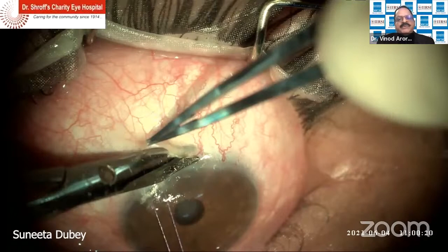What about leaving a little flower, a skirt of conjunctiva there? Yeah, that frill of conjunctiva. I don't do that. I cut it flush. Personal choice, I think. I don't think there is anything so much about it. And I don't think it's been documented so well, whether it gives any benefit or does not give any benefit. So, Kirti Singh, does it?